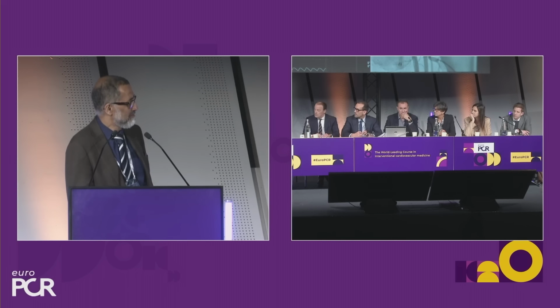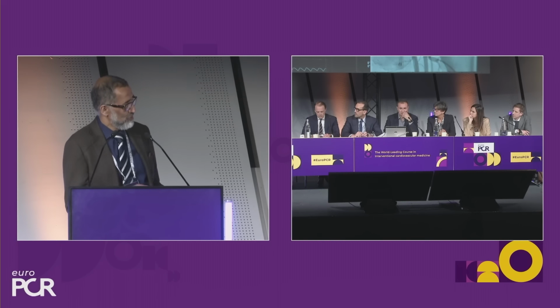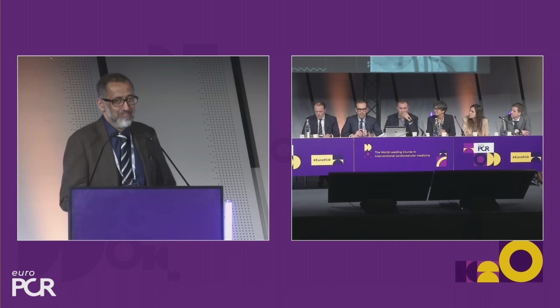So I didn't want to do a second balloon run, because although the pressure only goes down for a short period of time, this is a completely conscious patient. I'm talking to her through this. And so if you do too many pacing runs, they become aware of it, they start rolling downhill, and then you're into a situation where sedation starts to escalate. So she is communicating, we've told her we're pushing in the groin, we've told her that she's going to get a bit dizzy, and that means that she is perfectly able to tolerate the procedure. If I get stung by a bee and I didn't know there was a bee, I jump. If I get stung by a bee because I could see the bee on my hand, I'm jumping less. It's the same with the patient.